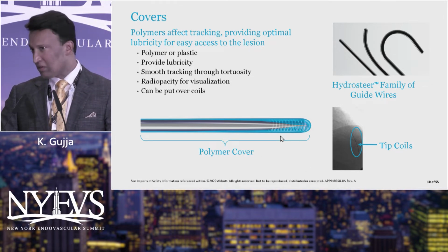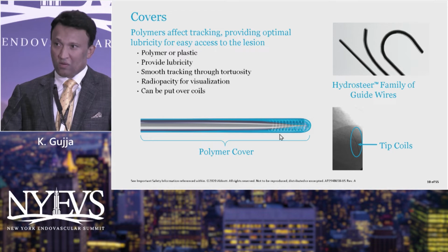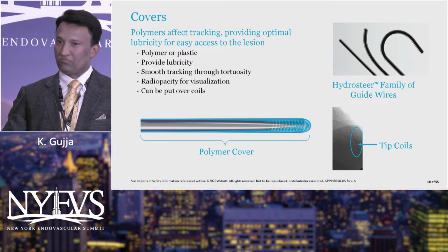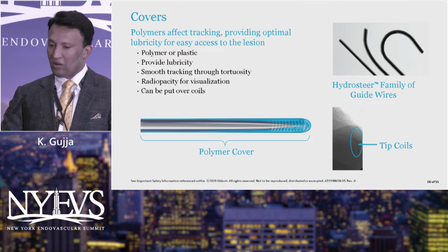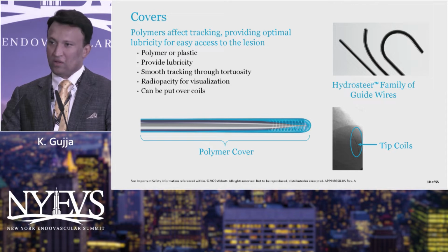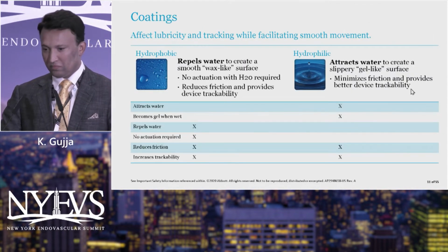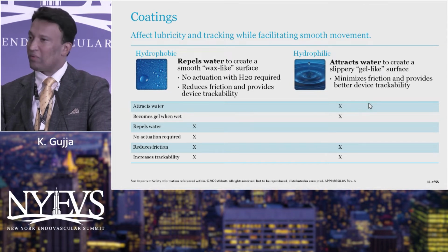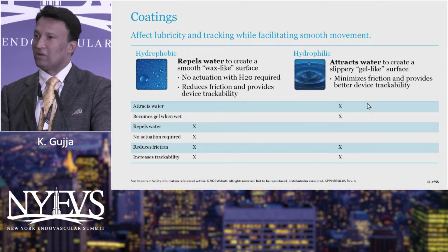Most of the wires we use now in the endovascular space, peripheral intervention space, or any interventional cardiology space are all hydrophilic wires. Hydrophobic wires are used extremely less nowadays. Lubricity, as I just spoke about, most of them are hydrophilic. Extremely rarely do we use hydrophobic wires.